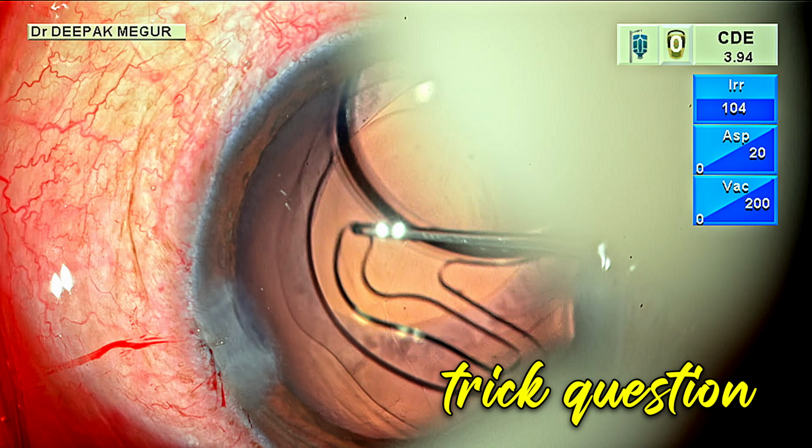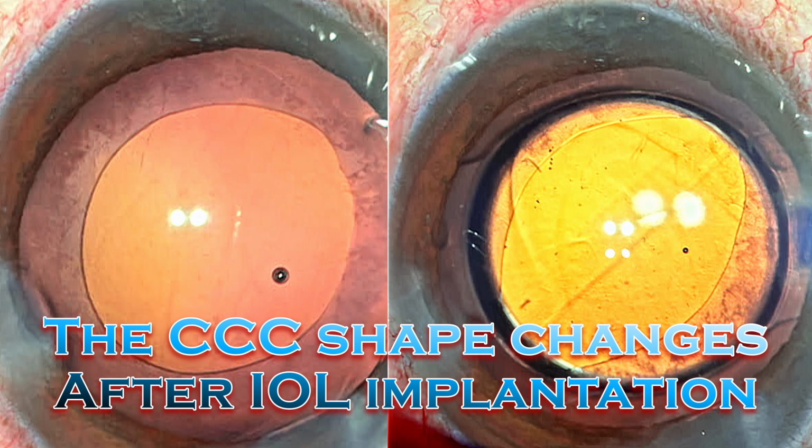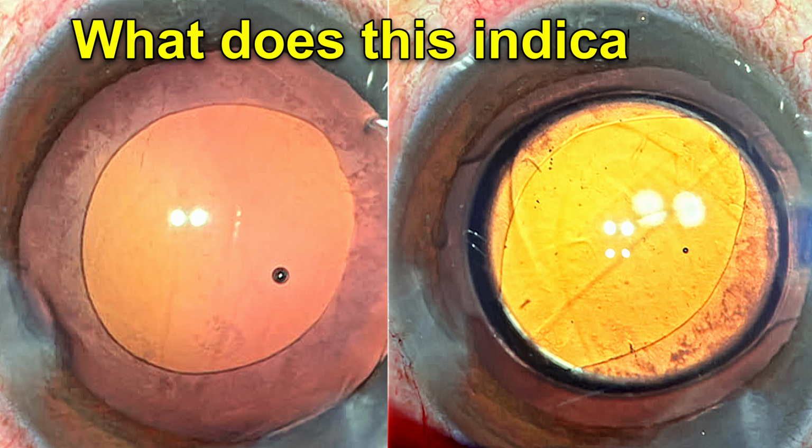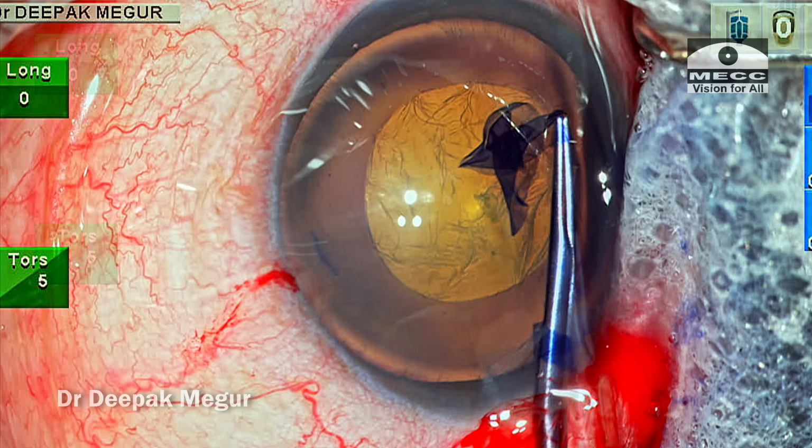Hi, I have a trick question for you. The CCC shape changes after IOL implantation. What does this indicate? Hi, I'm Dr. Deepak Megur and I'm here with yet another interesting case.